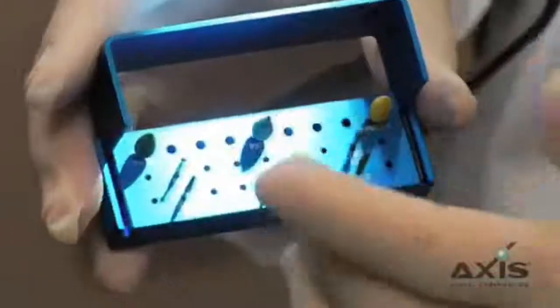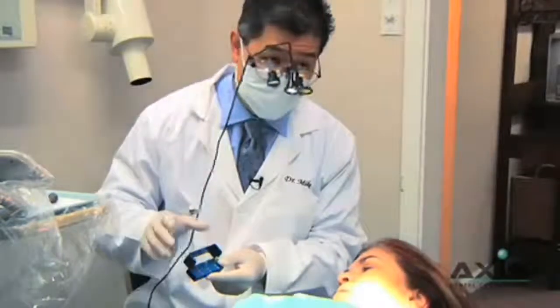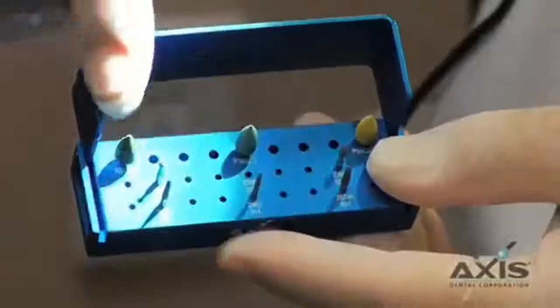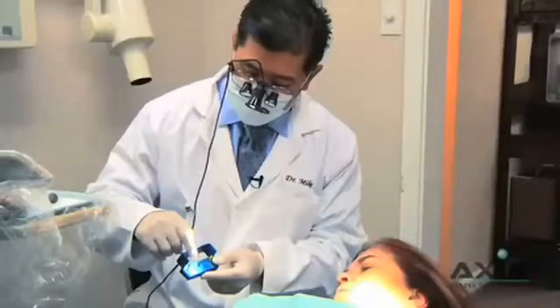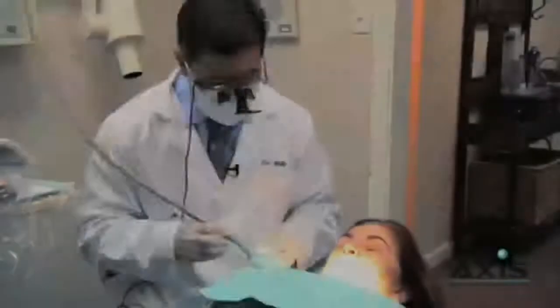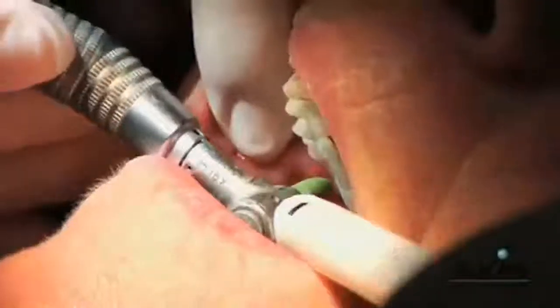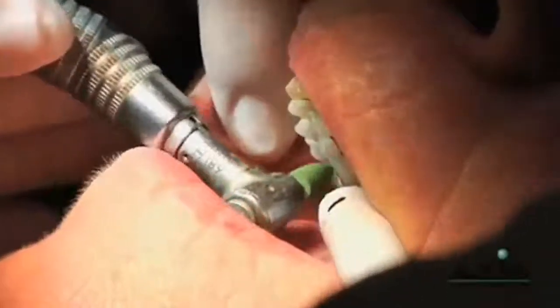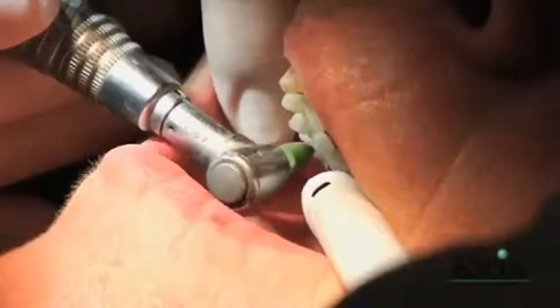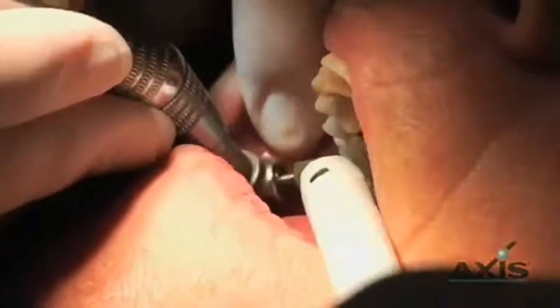Now we're going to show the Suroglaze System, which goes from green, to blue, to the ultra-fine yellow. We'll go in first with the green, just to take out any deep scratches that these Zurcut burrs may have left — and again, they're not very deep at all. Then we'll go back and refine with the blue. Make sure you get the scratches out with the green, and then hit any dull finish with the blue. To get the final glossy shine, go to the yellow. Right now we have the green and we're going in to remove any diamond scratches in the porcelain — just a little refining. Even on the buccal areas, if there were spots I wanted to refine, I could just use the green, going back over everywhere I hit the porcelain with the diamond.